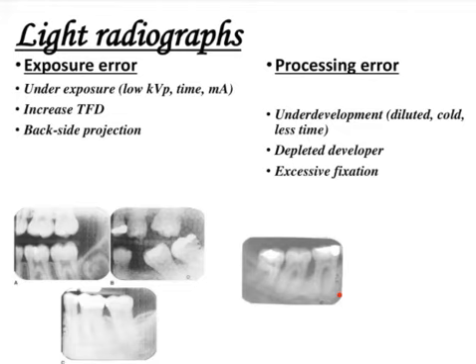If you leave it there long, it is going to become a light radiograph. Sometimes, if you leave it overnight, by morning it is going to be completely blank because the whole details of the silver halide will be removed and dissolved by the chemicals in the fixing solution. So you will find only the film base clipped to the hanger.